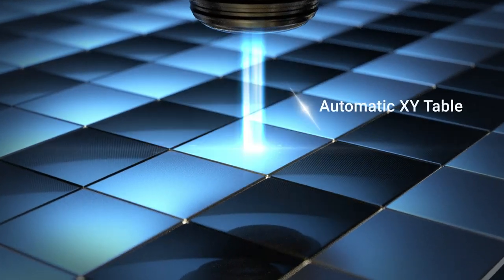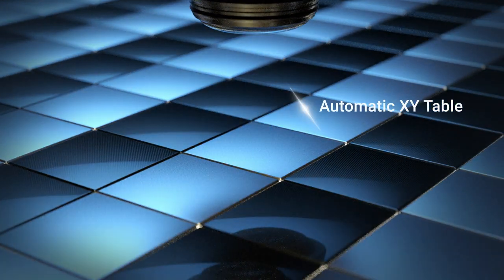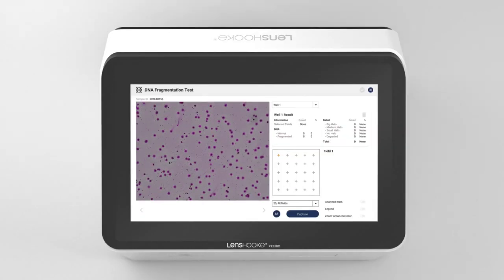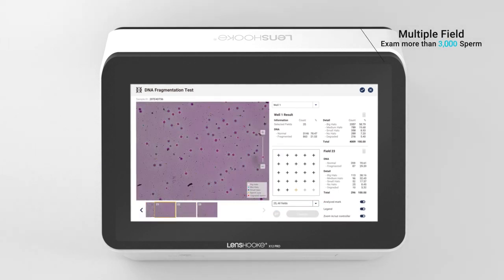The automatic XY table helps to move the slide to take photos for the different fields. Lenshook X12 Pro allows examination of multiple fields.